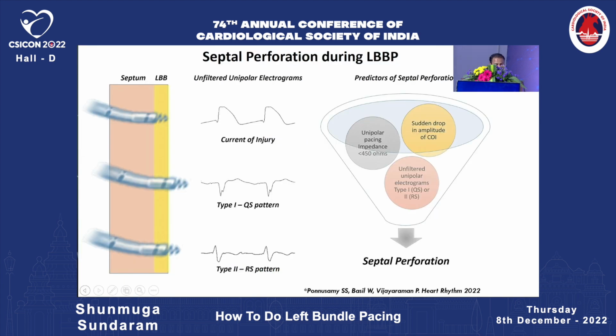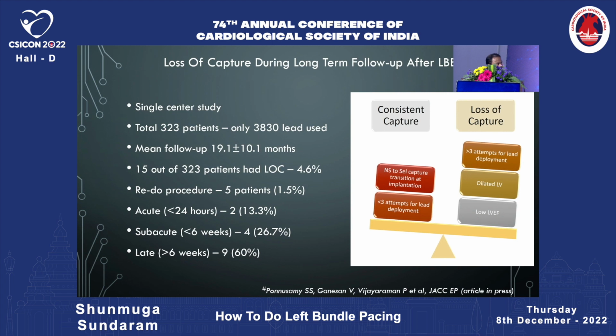Of course, lead dislodgement is there, and we have an incidence of close to 4.6% loss of capture during follow-up. The mean follow-up duration was almost 19 months. This was among 323 patients. All these patients underwent the procedure with the 3830 leads.